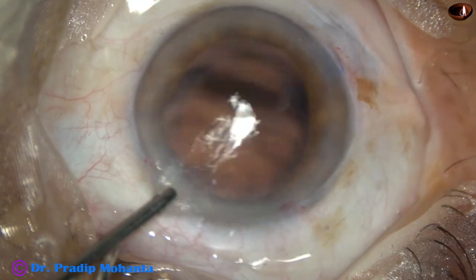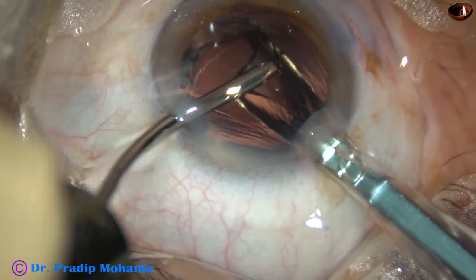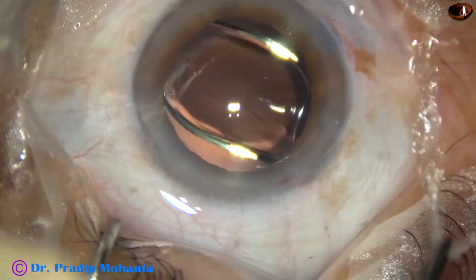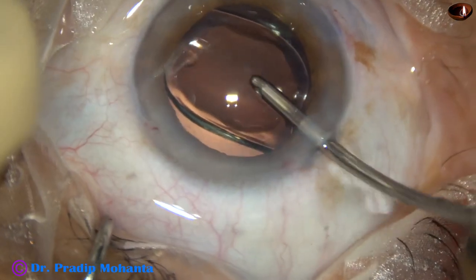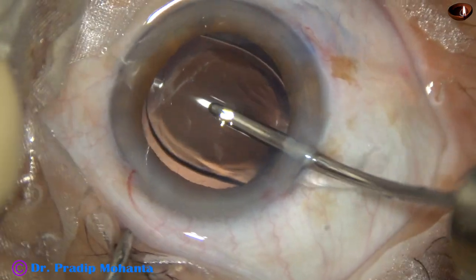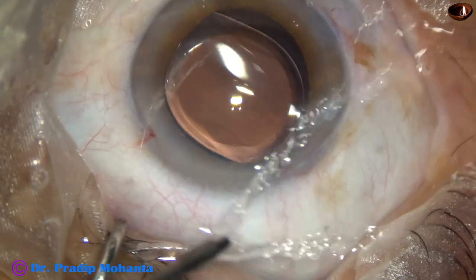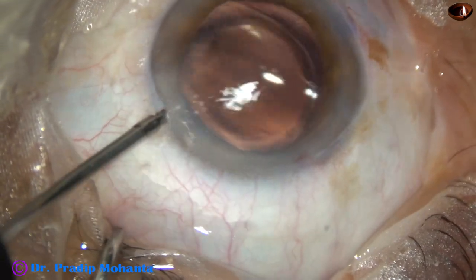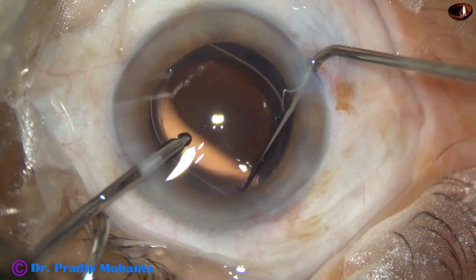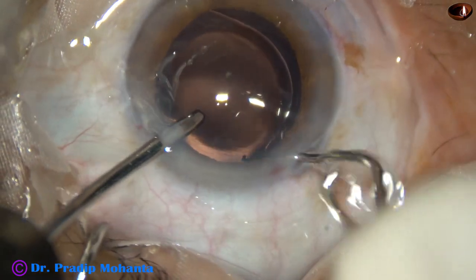An intraocular lens is being implanted through the 2.8 millimeter wound. This is a hydrophilic acrylic single-piece monofocal intraocular lens. The lens goes into the capsular bag by a push of the left-hand instrument at the haptic-optic junction. Whatever viscoelastic was in the lumen of the cartridge has come out. Just checking if the lens is in the bag — if we can hook the margin of the rhexis, then it is in the bag.